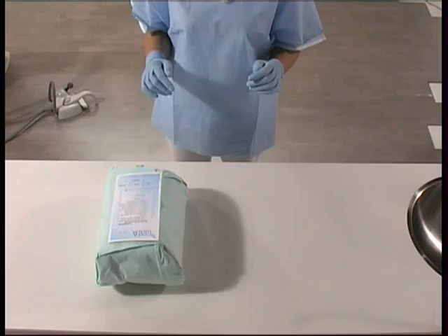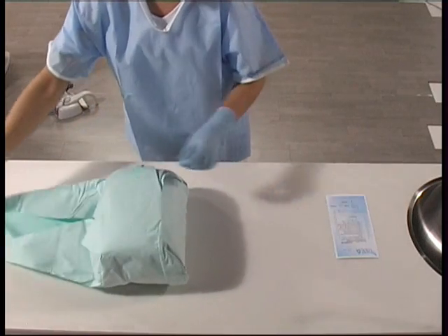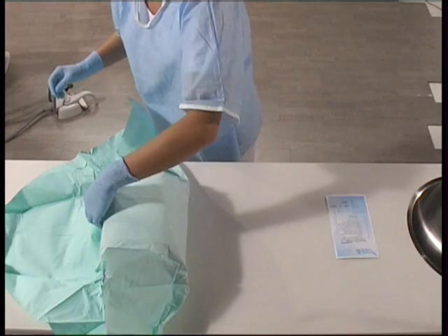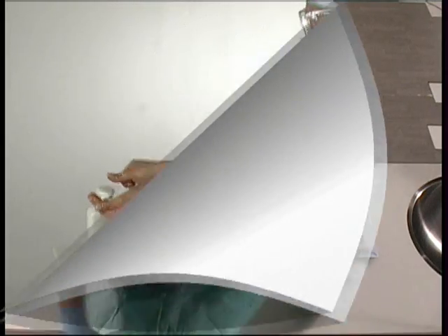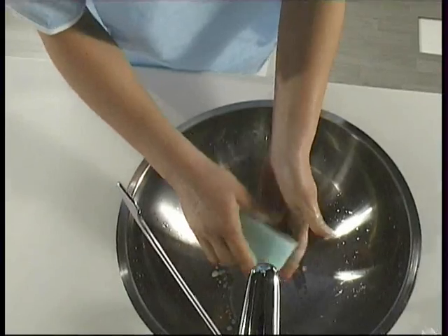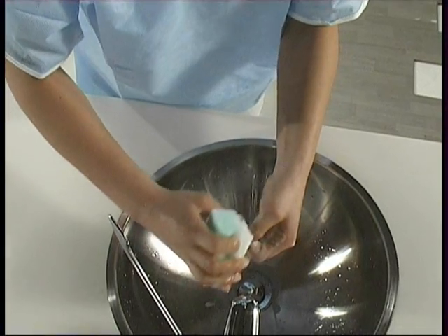Having completed this check, the assistant removes the surgical kit from the package and uses the tabs to unfold the second wrapping. The assistant then puts on the garments required by the specific protocol. Having removed any rings and bracelets, she then proceeds to wash her hands using ordinary detergent soap. Using a scrubbing sponge, she disinfects her hands, under the nails, and her forearms.